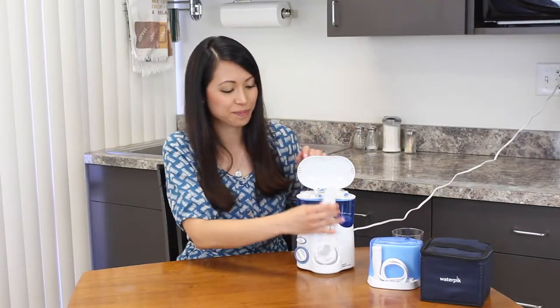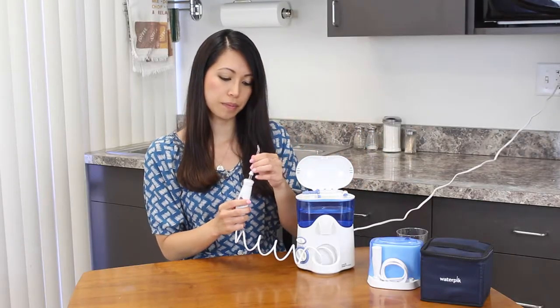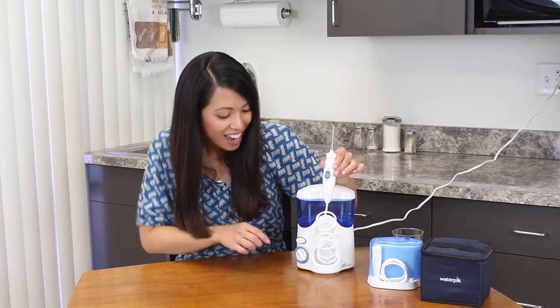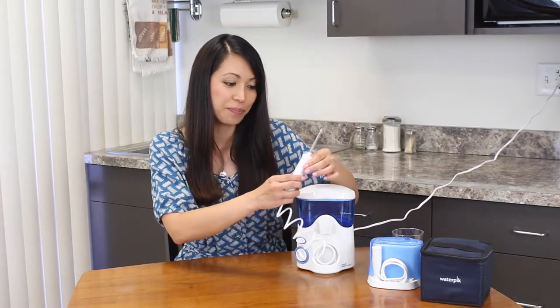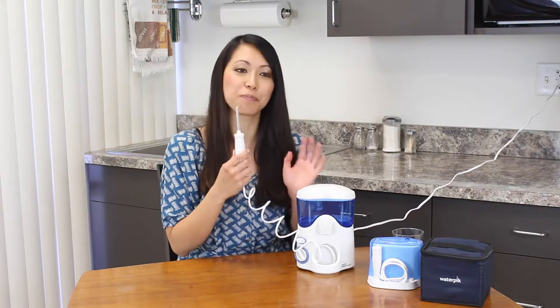I'm going to select the classic tip, click it into place, turn on. What a loud noise. And I'll select my power — I'm going to do it pretty low to start because I don't know what to anticipate here. And then I need to turn the on switch to start water. So here I go.